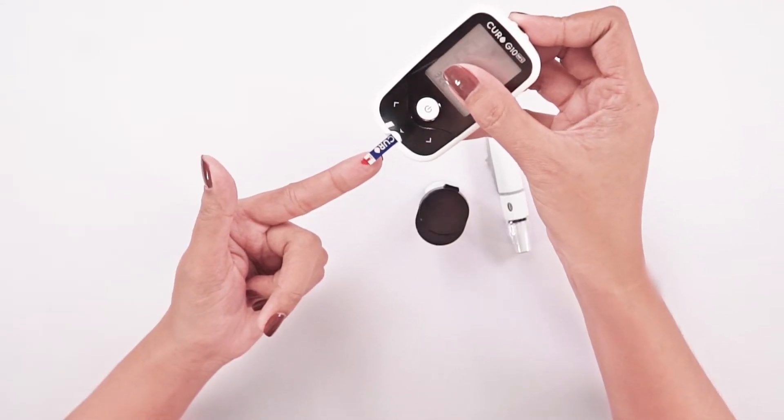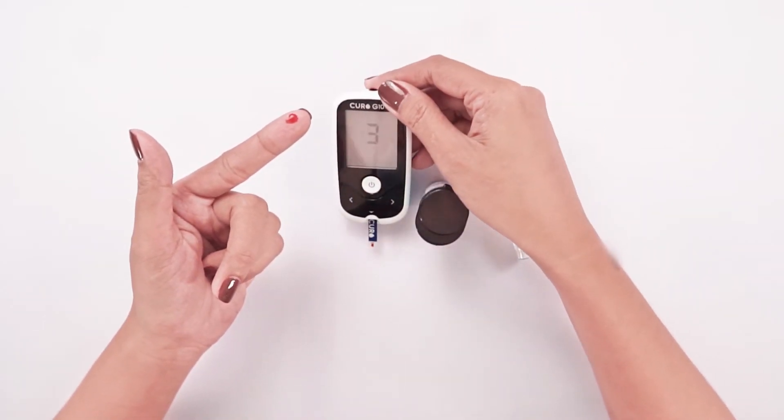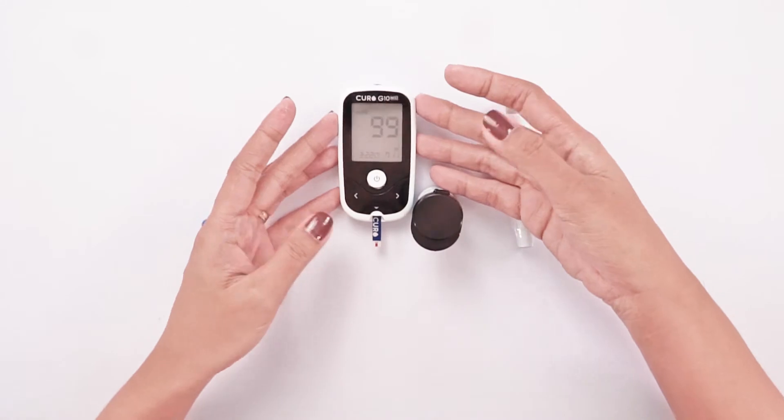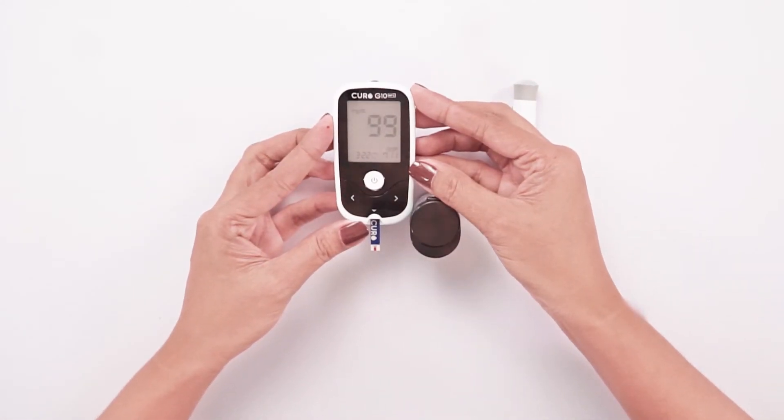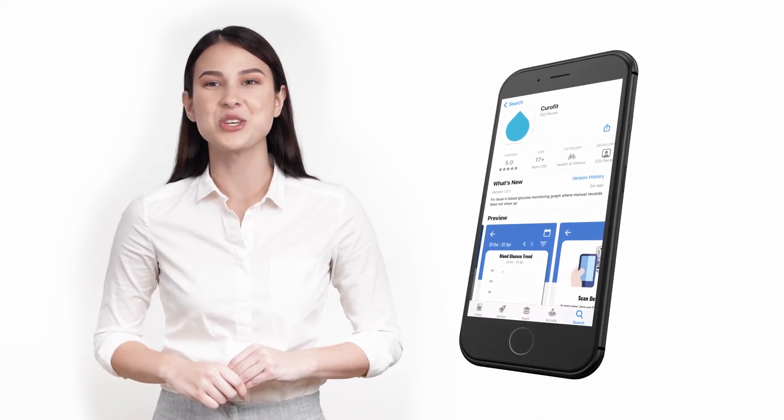When the chamber is full, the Curo G10 blood glucose meter starts to measure the blood glucose level. The blood glucose result is displayed on the meter's LCD display. Curofit also made it possible to track glucose levels conveniently using the Curo mobile app.